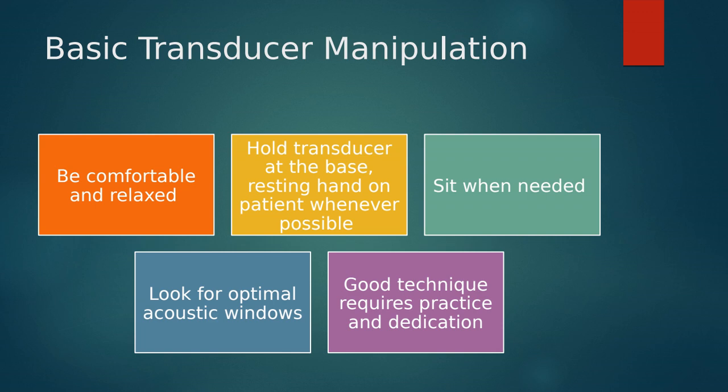You want to sit to scan when necessary. Now, some of you are really, really tall. Some of you are on the shorter side. So sitting may not be helpful for you guys.